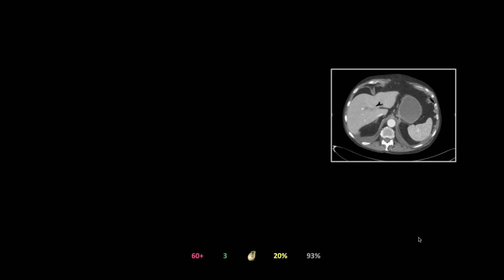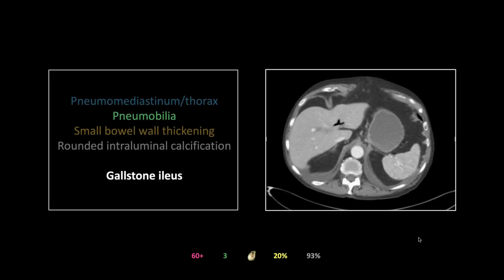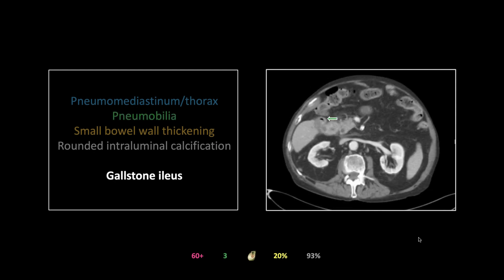There is pneumobilia — centrally located, branching, pretty typical appearance — and a decompressed gallbladder with a little gas within it, right up against the duodenum. I used to look for a big distended gallbladder full of gas, but I stopped when I realized that was foolish: when this happens, a fistula forms between the gallbladder and the duodenal lumen through which the gallstone has passed, so by necessity the gallbladder will be decompressed. You have to look closely — it's easy to confuse that gas with a redundancy of the duodenum.